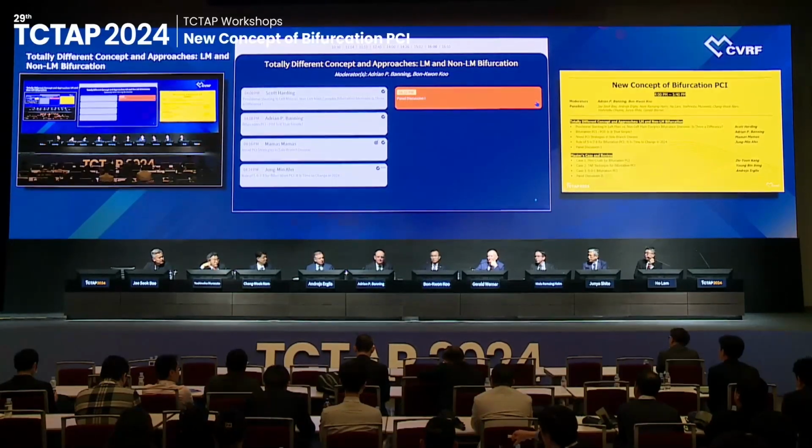As you are standing, make a comment regarding the FFR. You said FFR, and we need to think about the territory. Yes. But the thing about the FFR is that it physiologically takes into account the territory. So the same degree of stenosis of diagonal 1 will result in a different FFR than diagonal 3. Diagonal 3 will not be significant, because the concept of FFR is the subtended myocardium. So we can rely on FFR for the side branch. It will not lead you to a treatment of diagonal 3.